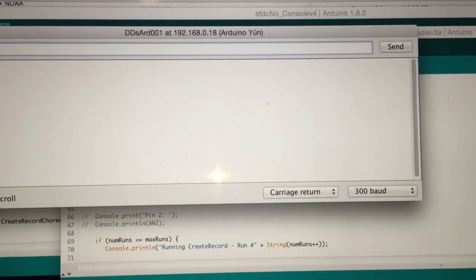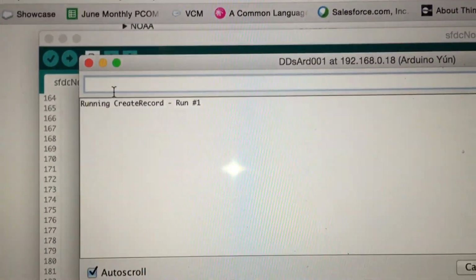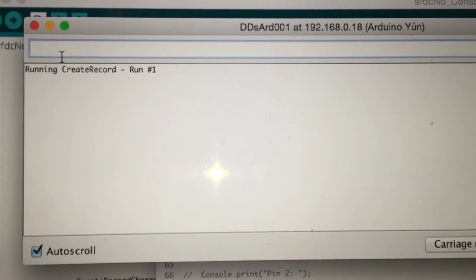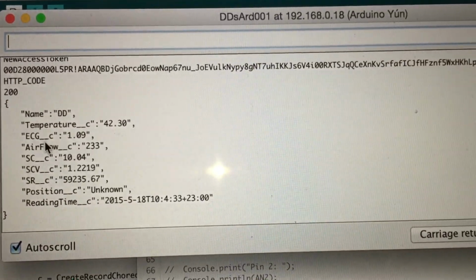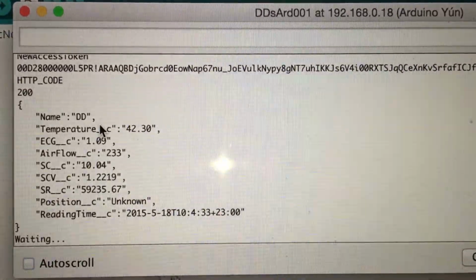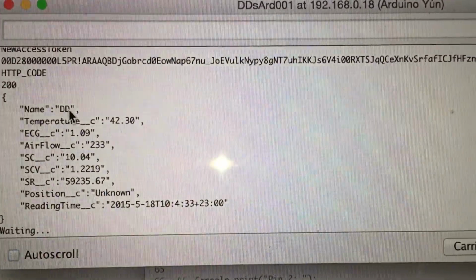I'll get the serial monitor on. Okay, it started. And it's writing the first one. Let me just put the auto scroll off. As you can see, what have I done? It's telling me it's me. Of course, I've just put my name in there.